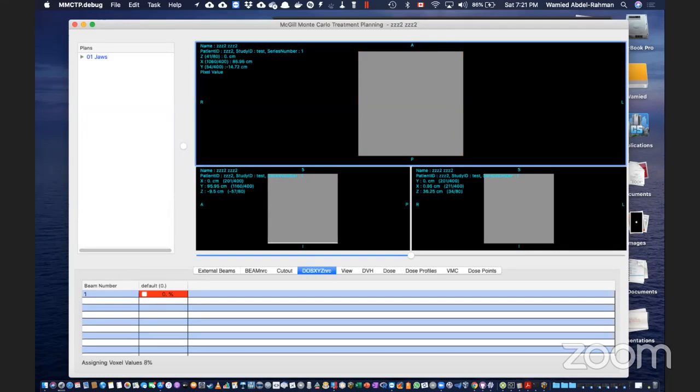So any comments, Andrew, do you want to add something? No, I think you're correct, though, by deselecting the contour option. It's a smart move. Yeah. We're going to check now, because I think that was causing the problem. Once I generate the phantom, although I want everything to be water, it defaults back to air. That's the problem I was facing. We're going to see how it looks now.